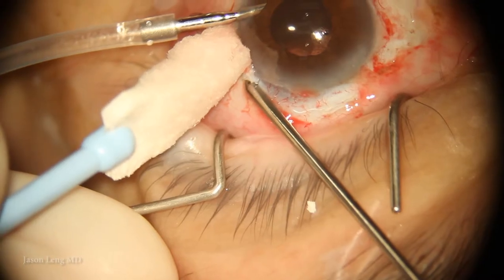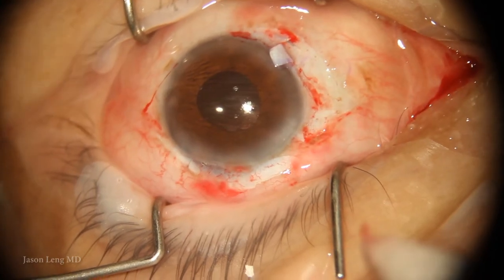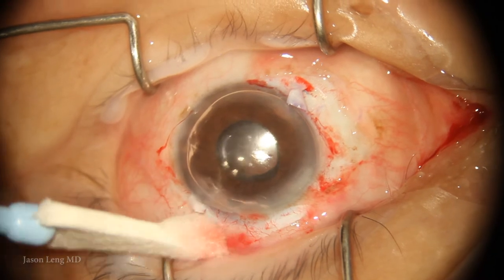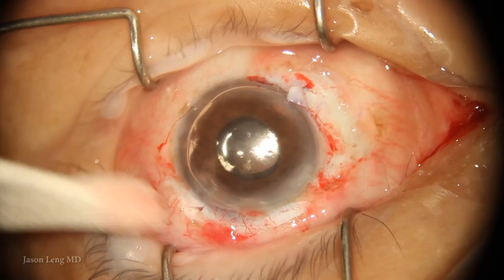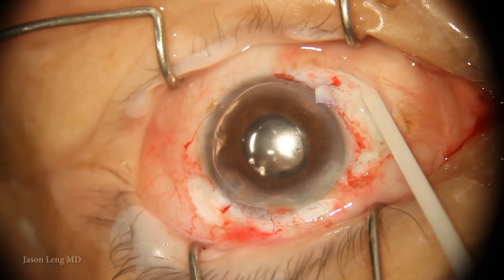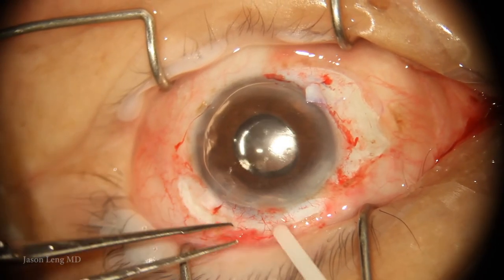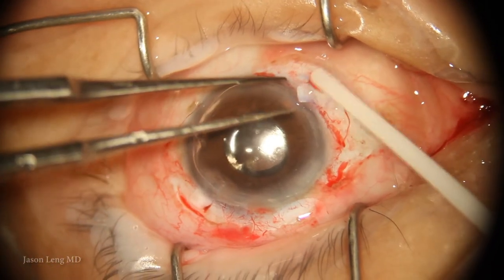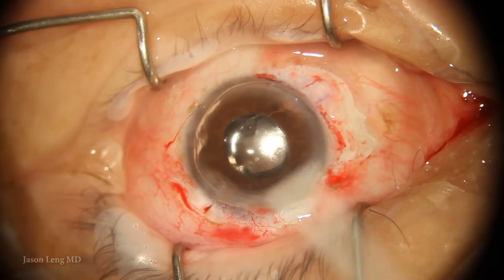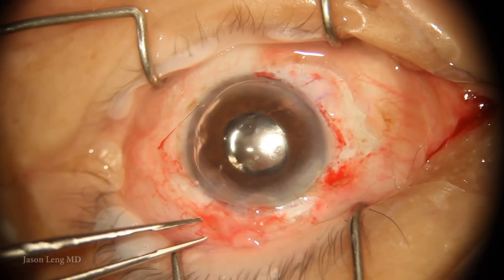I use a little anterior vitrector to clean up any tiny strand of vitreous that may have come through the sclerotomy. I remove my AC maintainer and insert the anterior chamber maintainer to keep the chamber formed. I make sure everything is dry — you have to take the infusion out as water will shoot out of the sclerotomy while you're trying to glue. Here I'm applying the fibrin glue. The main purpose of the glue is to seal the flaps and the conjunctiva — it doesn't really add support to the lens; it's just to prevent leak or hypotony in the immediate postop period.